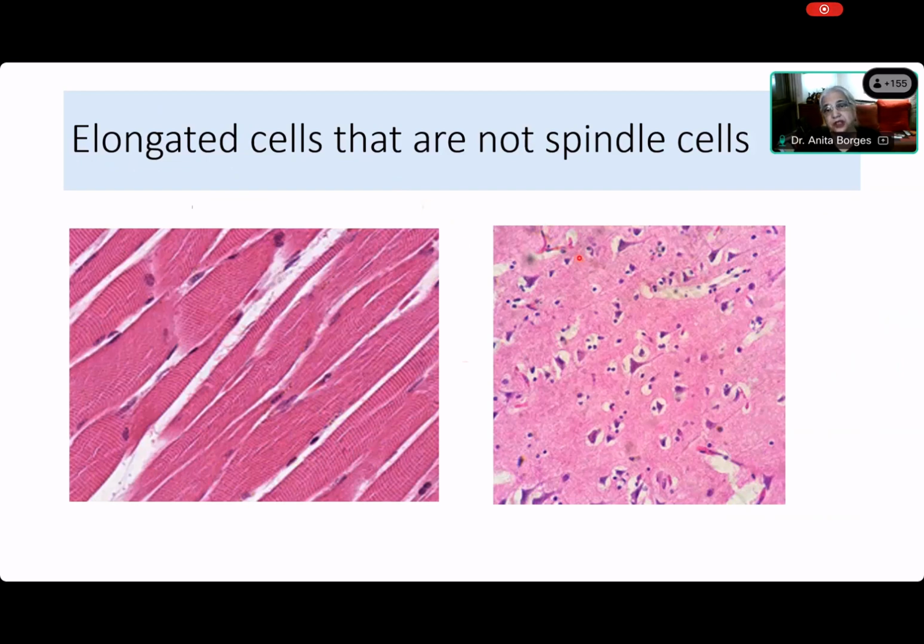Okay, and now here you have another elongated cell. You see the long axons, but these are neurons, and we don't refer to neurons as spindle cells. The nuclei anyway are not spindly; they are round, but they have very long axons that sometimes go all the way from the base of the skull, depending upon what nerve you are talking about. The axons can travel long distances, and those are not spindle cells.